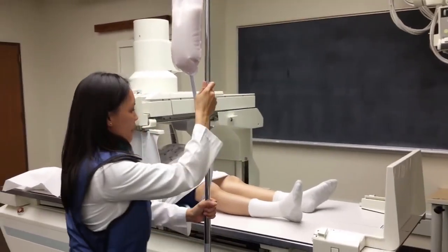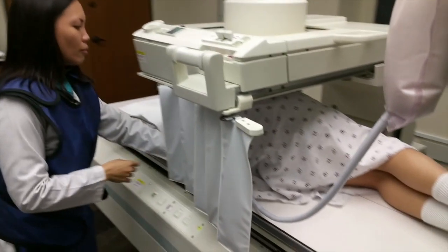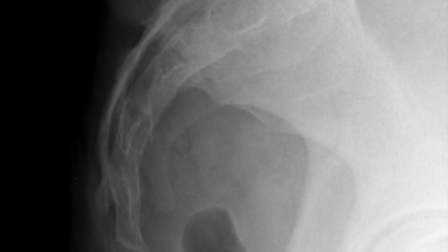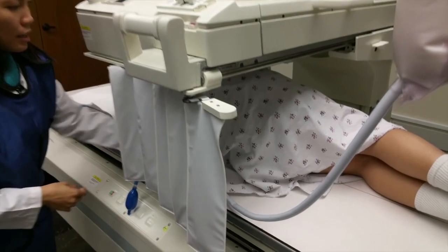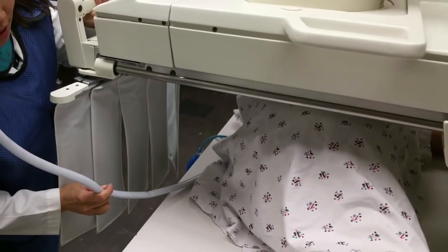position on an IV pole to allow the contrast to flow. The patient is usually in somewhat of a left lateral position after the rectal tip is placed. I like to take a quick look at the tip in position, especially if a retention cuff is used, in order to ensure it's in the proper position and the cuff isn't over or under inflated.